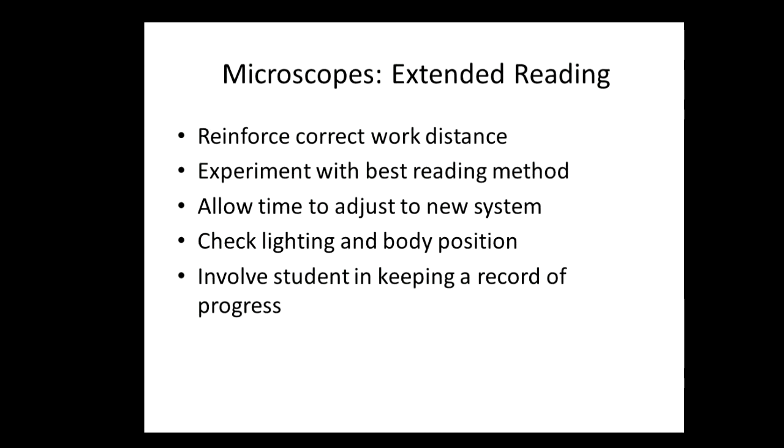Lighting and body position with microscopes, again, these are important. Because the material is so close to the face, it's important to find that angle of where the light works best and having a body position that's comfortable. Some students will prop up their knees and rest the book there so that they can bring it closer to their face, or use a cushion and rest their arm on the cushion and hold the material up. So encouraging the student to develop their own system on this is very important.